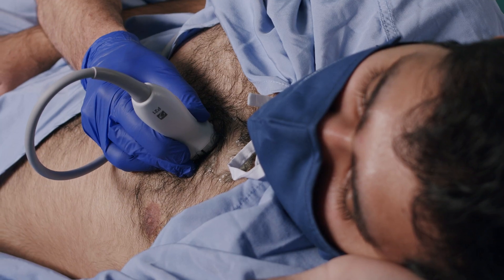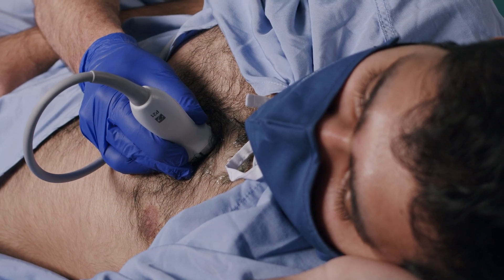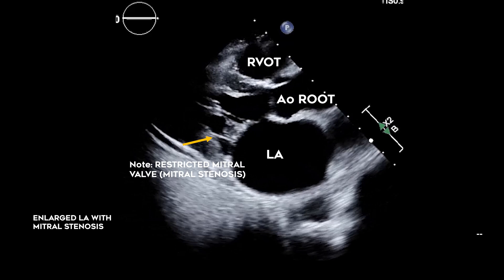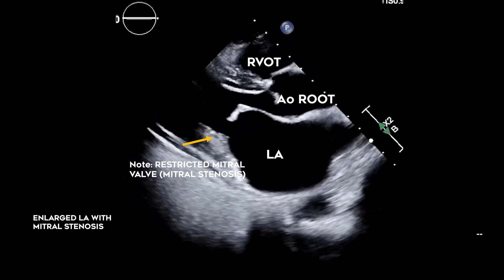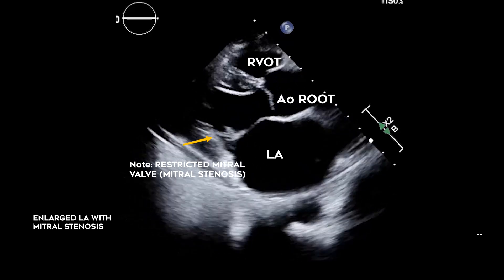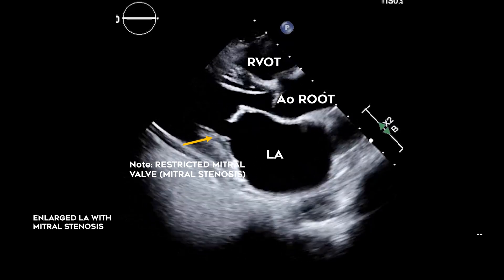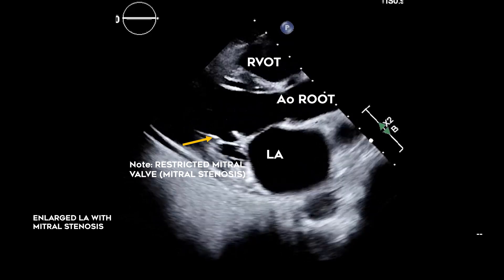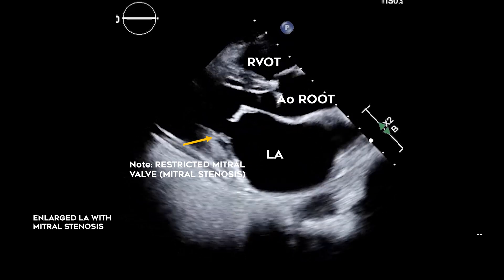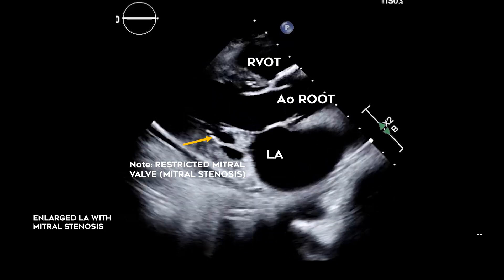Significant left atrial enlargement can be eyeballed from the parasternal long axis view using the rule of thirds. It may indicate mitral valve disease, diastolic dysfunction, or long-standing atrial fibrillation.